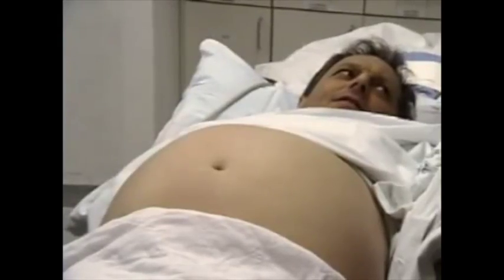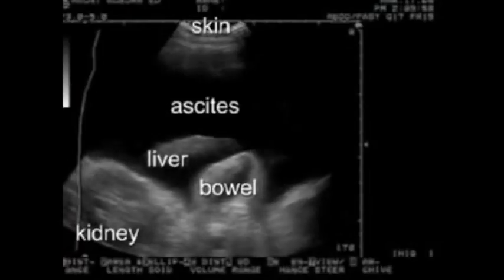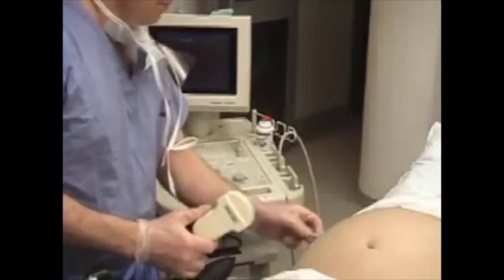Position the patient supine in the bed with the head slightly elevated. Bedside ultrasound should be used to find an appropriate location that contains ascitic fluid but is devoid of loops of bowel or solid organs. Mark the site of needle insertion with a skin marking pen.